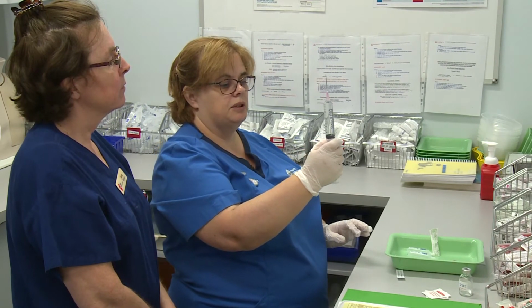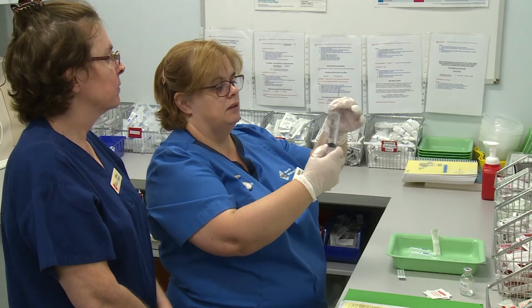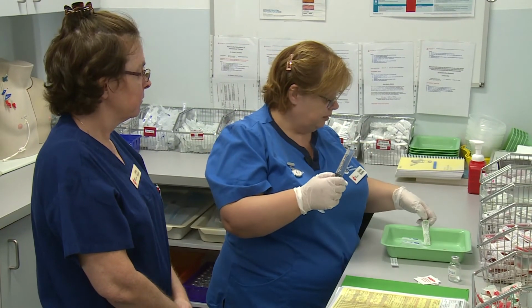Okay, make sure I have 20 mils. Get rid of that. Again, all the time, every time I go near it, I'll make sure I don't touch my key parts.